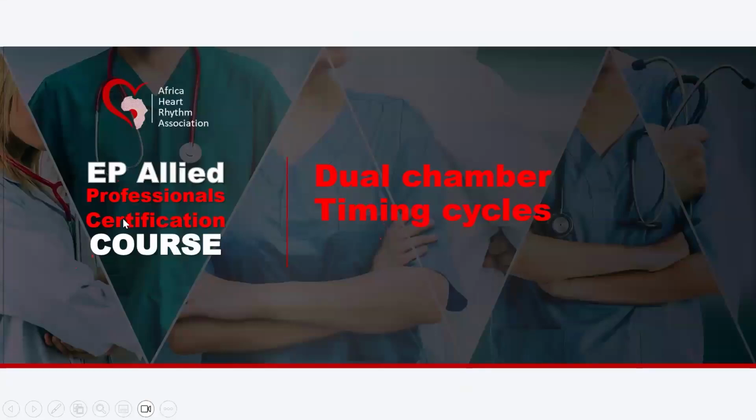Pour un pacemaker double chambre, on doit aussi essayer de comprendre comment il fonctionne, les timing cycles, et surtout ce qu'il contient comme compteur, parce que dans ce cas-là, on a les deux cavités : l'oreillette et le ventricule.